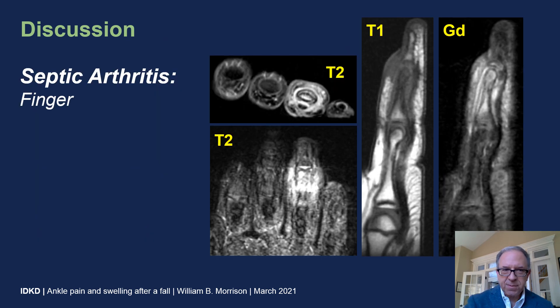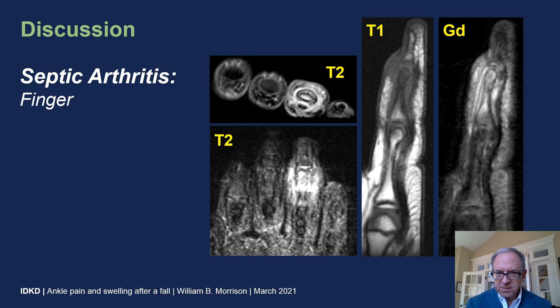Another example: septic arthritis of the finger. Notice that there's not a large joint effusion here because there's not a large joint capacity. In small capacity joints, the fluid from septic arthritis often decompresses — it can decompress into the adjacent soft tissues, into a tendon sheath, into a bursa, or elsewhere.